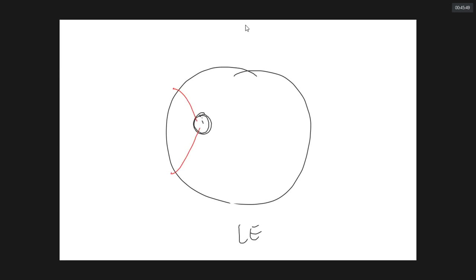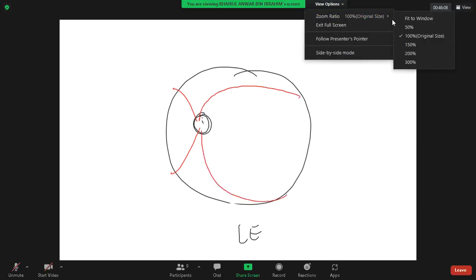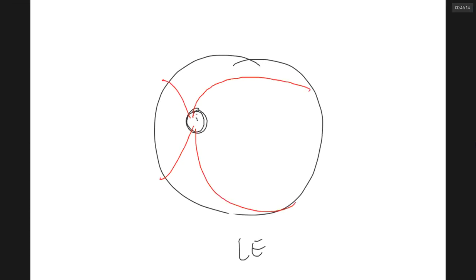Let's say this is a glaucoma patient. Okay, you see that when I'm drawing, let's say this is absolute glaucoma. Our patient is actually blind already, and then the cup is full. Usually, we draw the superior and inferior temporal arcades near to the nasal arcades, which indicates that it is already shifted towards the nasal, or what we call nasalization of the vessels.